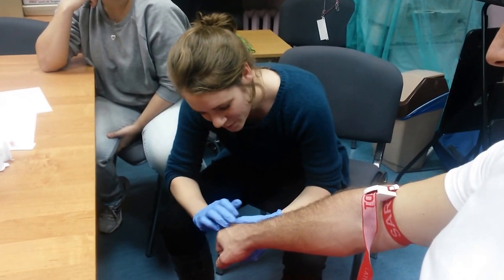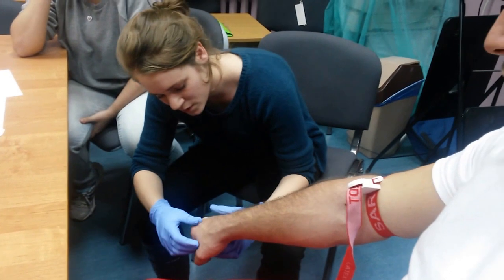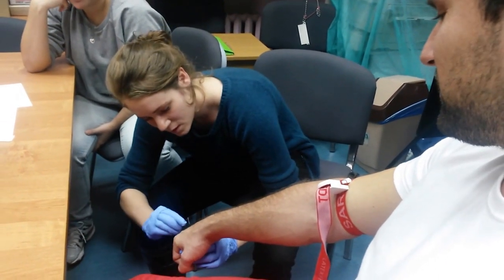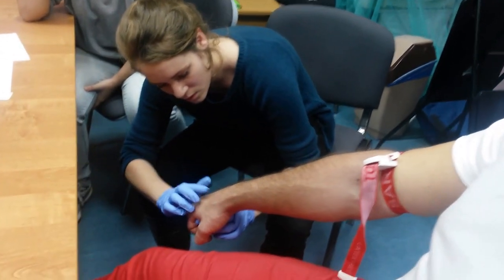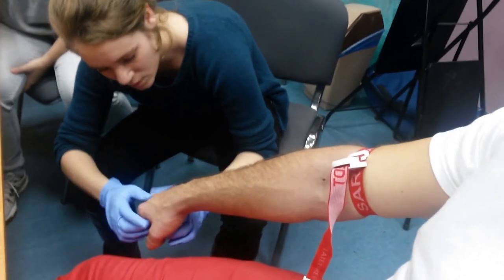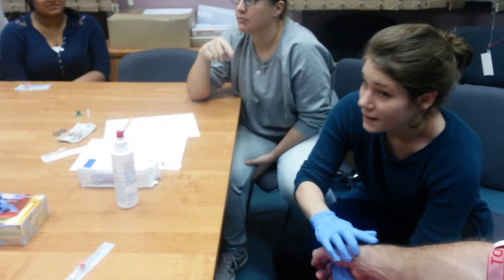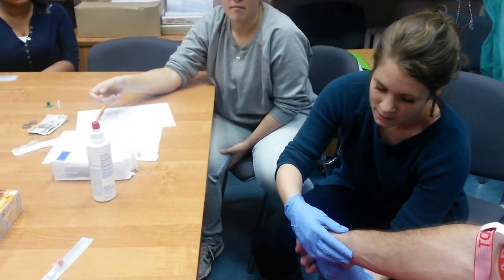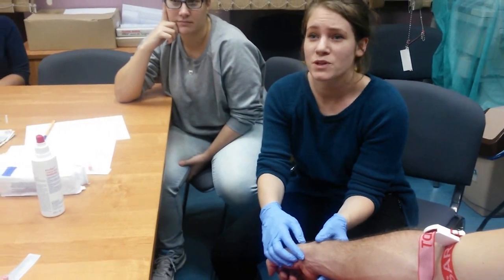This is a nice one, except you've got your bifurcation here. If you haven't really done this before, use your time to feel the veins with your fingers so you know how big they are and where they go — just get familiar with it. To be honest, I don't know; I haven't done much of these.